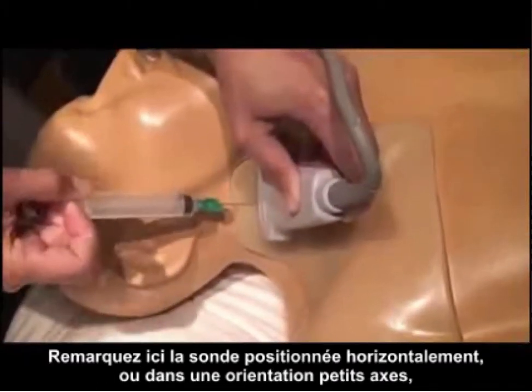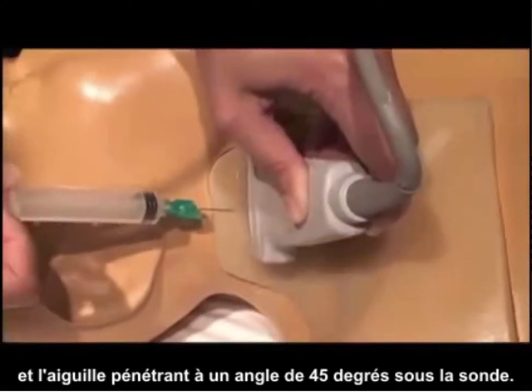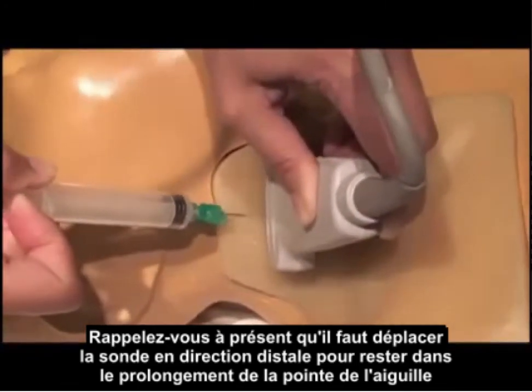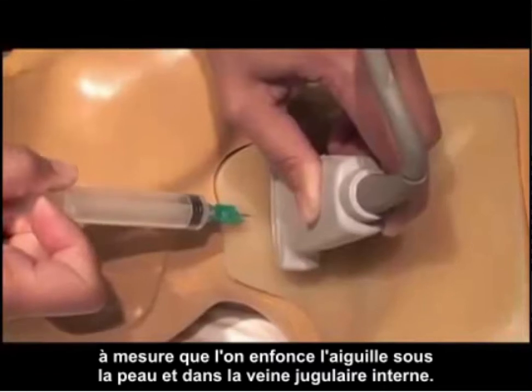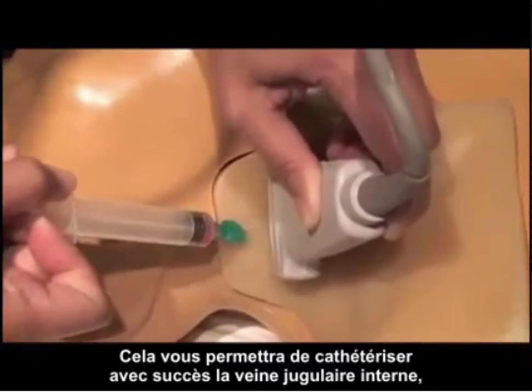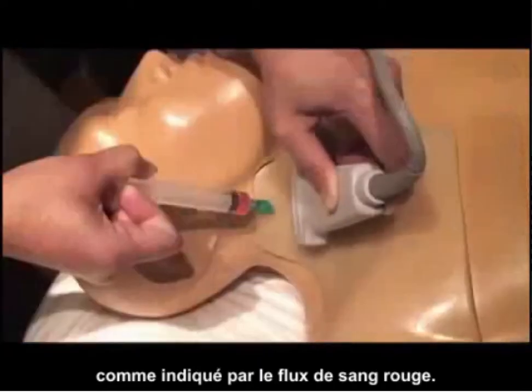Notice here we have the probe in a side-to-side or short axis orientation and the needle coming in at a 45 degree angle underneath the probe. Remember that we must move the probe distally to stay in plane with the needle tip as we advance it underneath the skin and into the internal jugular vein. As we do that we notice that we've successfully cannulated the internal jugular vein as shown by the red flow of blood.